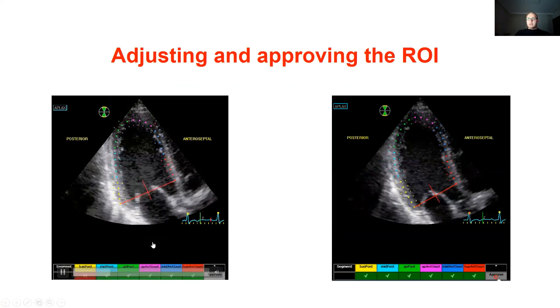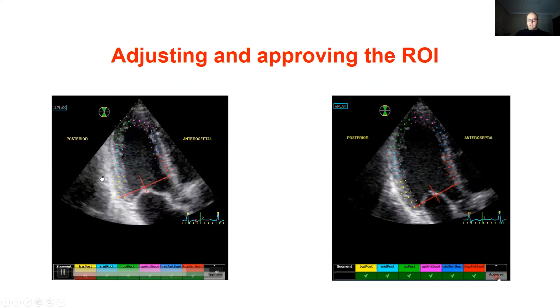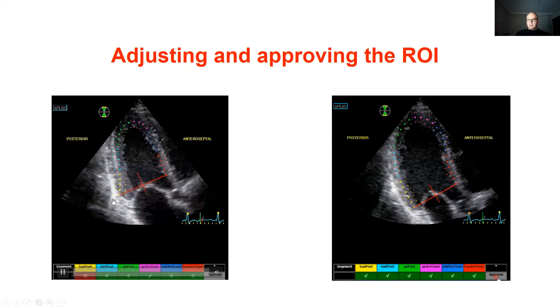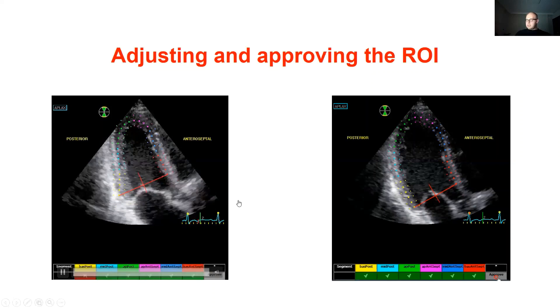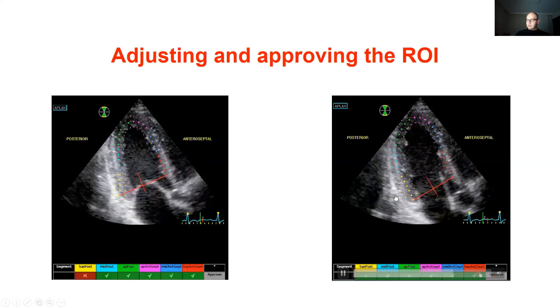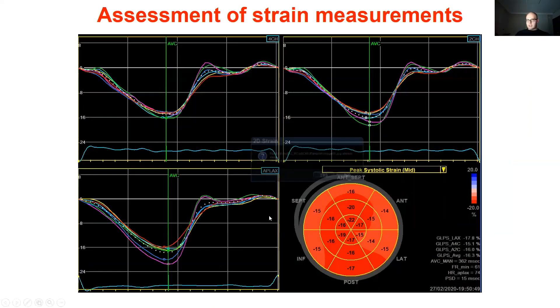Check carefully if the region of interest motion is following the myocardial motion. If there are badly tracked segments, such as a posterior basal segment, it can be adjusted and corrected to obtain proper tracking.